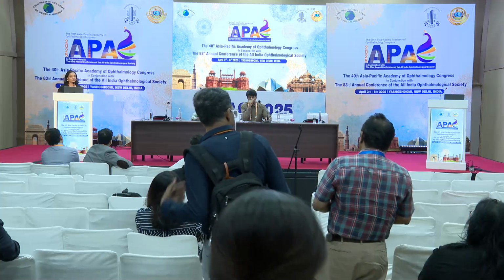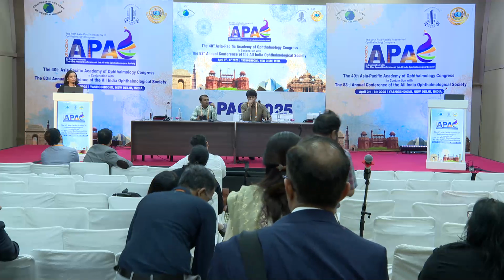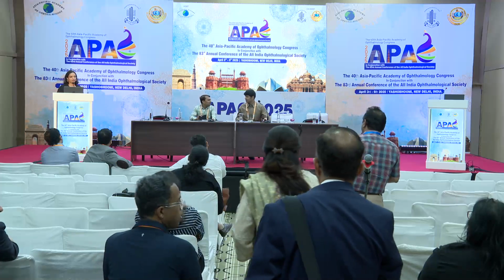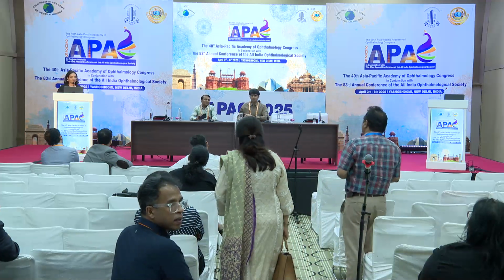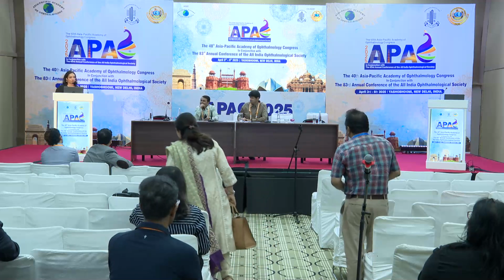Okay. OCT is still the modality for the win in DME, but OCTA only if suspecting macular ischemia. FFA also helps, but it is invasive. If you want to plan a focal laser, then FFA is the way to go.